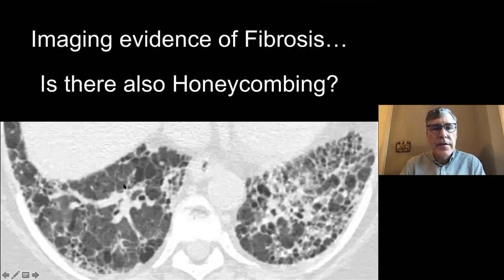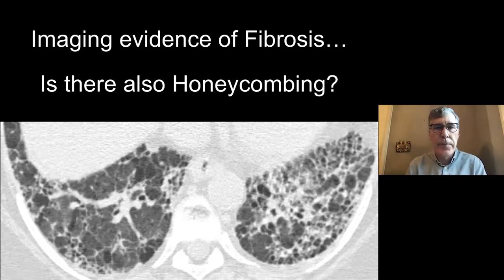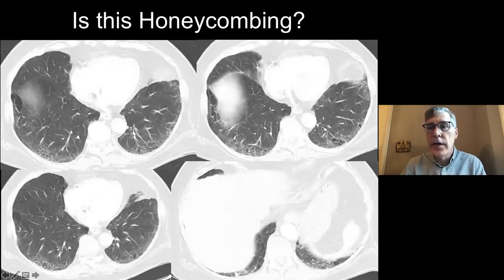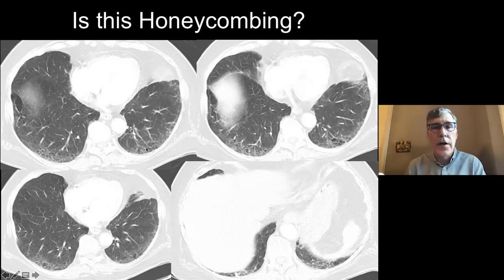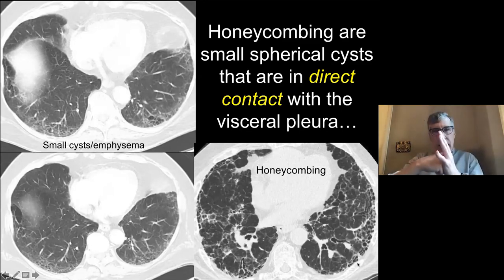So take a look: is there imaging evidence of fibrosis? Yes — irregular visceral pleura for sure, reticulations, a little ground glass with some fibrosis. Is there also honeycombing? These look like they're right up against the wall — yes, I think there's honeycombing. This patient has usual interstitial pneumonitis, UIP. Now, does this other patient have honeycombing? They have reticulation, ground glass, and little cystic areas — but take a close look: they are not up against the pleura. This is not honeycombing. These were actually little cysts or emphysema. Compare that to true honeycombing, which is right up against the pleura — remember, it has to be against the pleura.